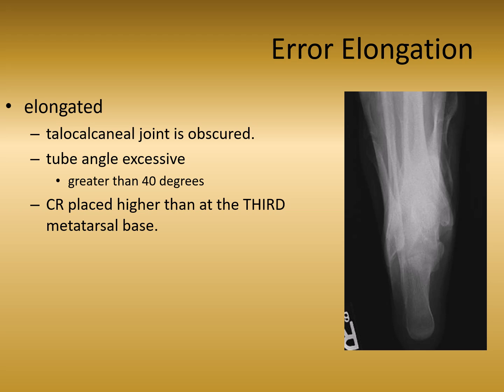Now this one is showing elongation and complete obliteration of the talocalcaneal joint, and metatarsals being completely projected down into the areas of interest. So, these lines we're seeing here are actually metatarsals being projected down near that talocalcaneal joint, what we want to see. An elongation of the calcaneus. It looks long and skinny.